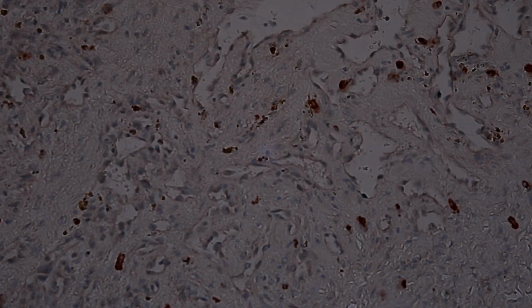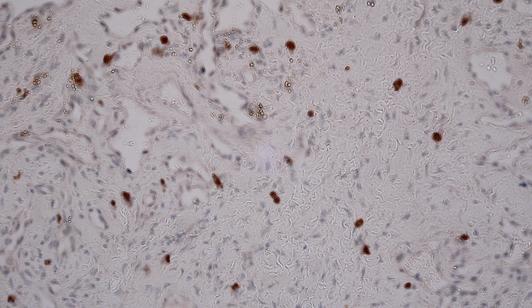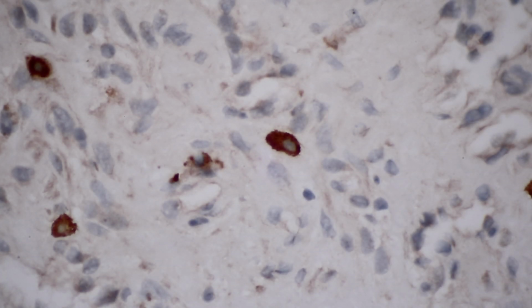So why on earth are mast cells labeling with pancytokeratin? They clearly don't make keratin filaments, but they label with the stain. So let me get closer here to show you the way that you can tell they're mast cells. You can see that the nuclei are negative, and that the cells have kind of a fried egg sort of shape, like this little guy down here. And it's a little hard to pick up on video, but there's a granularity. You can see that it's the granules usually that are picking up the stain. So the staining is usually kind of granular. And it's a little bit tricky to get on the video, but you can tell that's a mast cell right there.